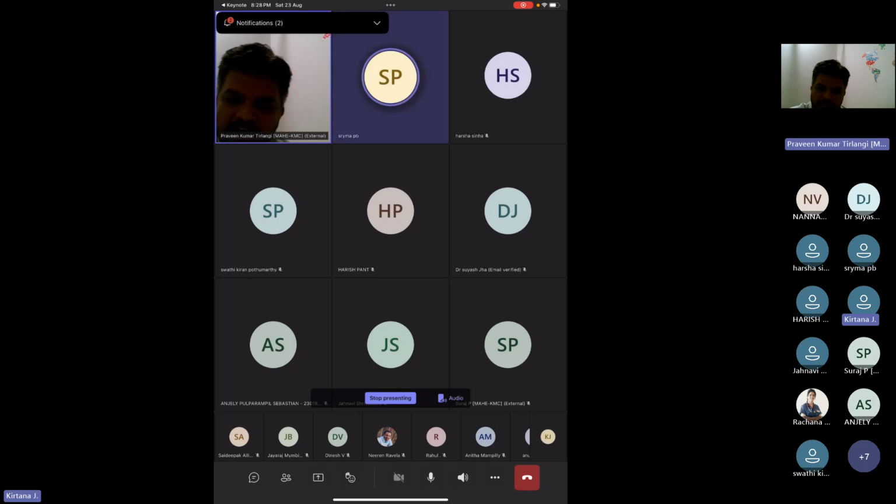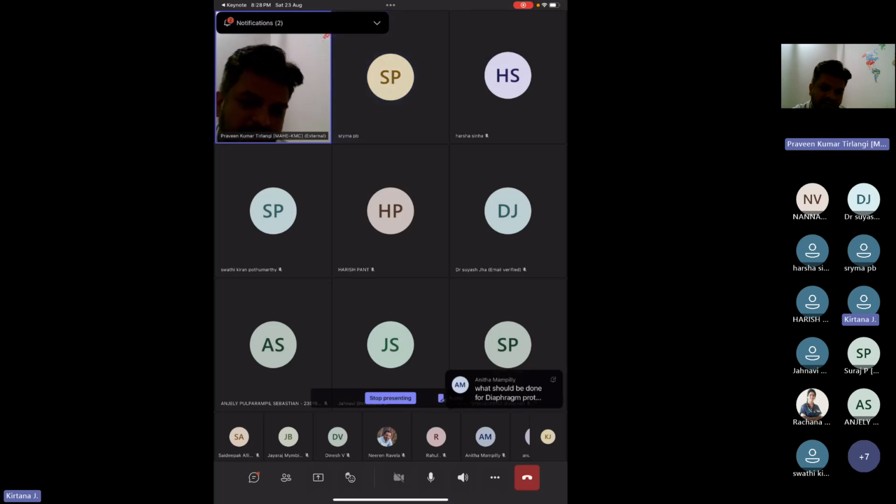We also keep seeing this in pressure control. The patient is not deeply sedated, having a lot of effort, and on pressure control the volumes are high. The same thing we see in patients in PCV, where the patient is having a big effort. People think that the compliance has increased, that it is getting better, because the volumes are high.